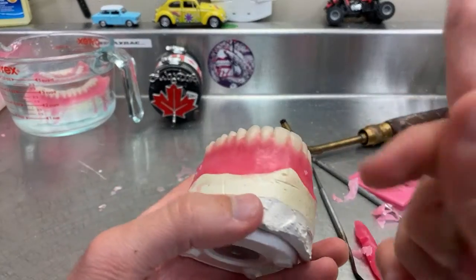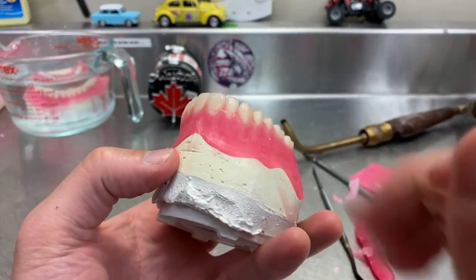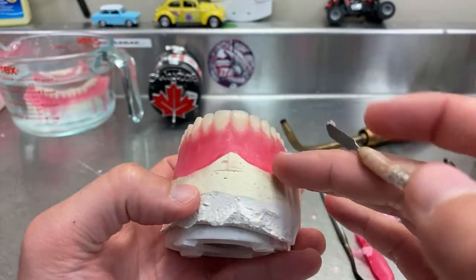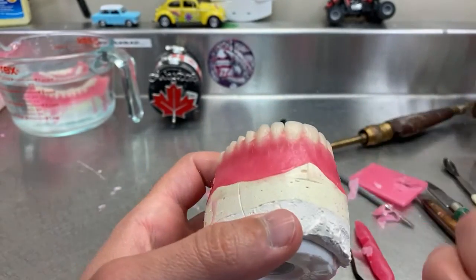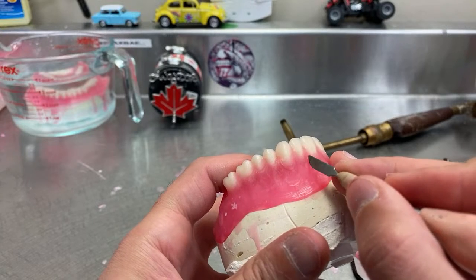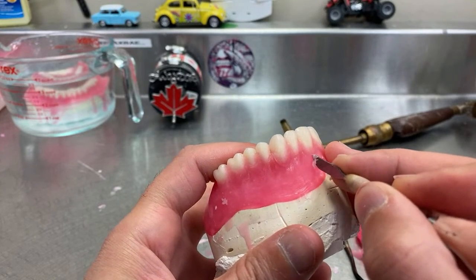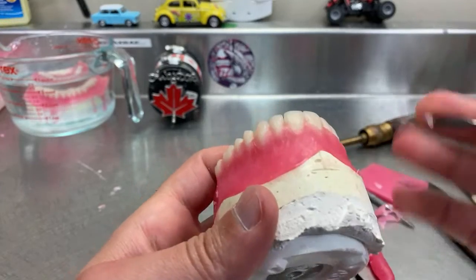And as I said, this side does not have to look 100% like this side. Yeah, you have to use the same style of carving for both sides, but I like to give it that random look. That's what gives it the natural feeling.